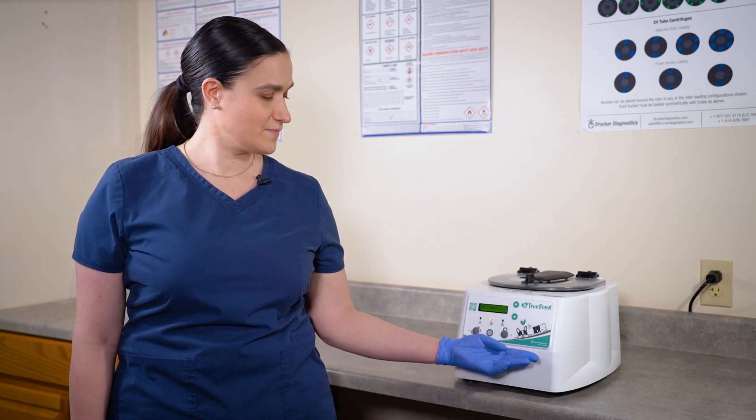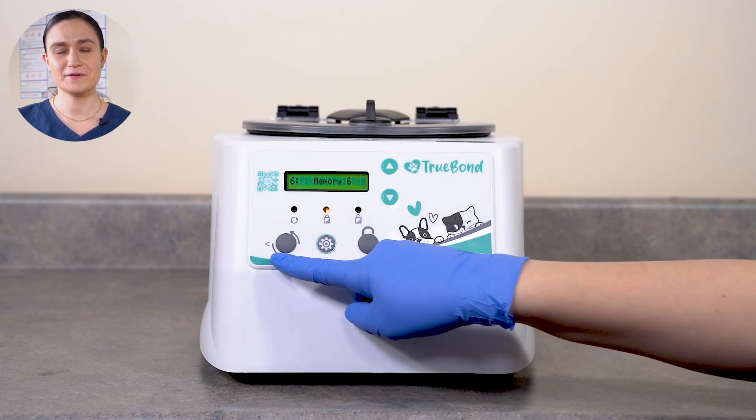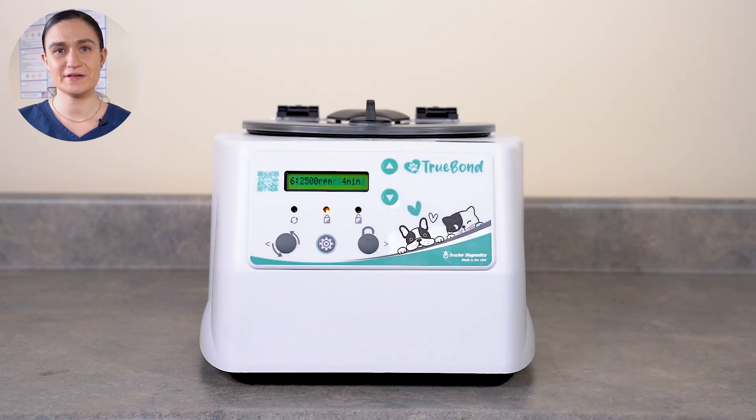As a quick reminder, your TrueBond has all of its controls right here on the front panel. Today we're going to use all these buttons as we create a new cycle by editing Memory 6.